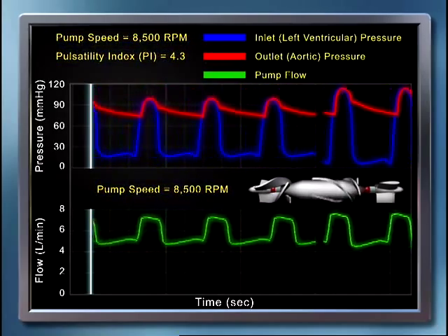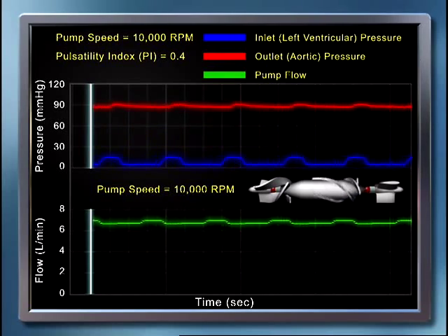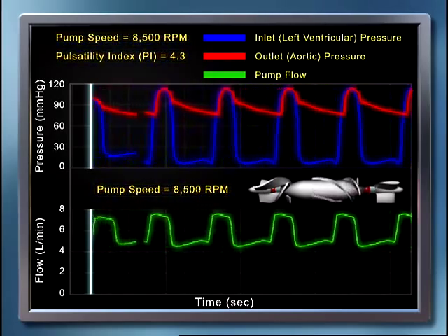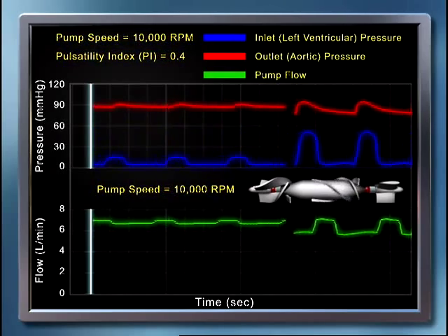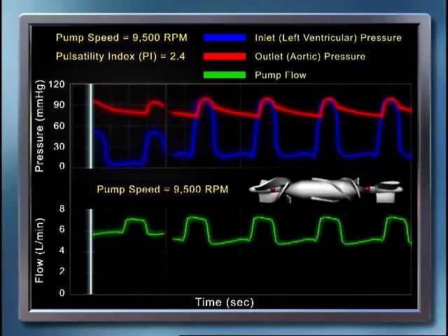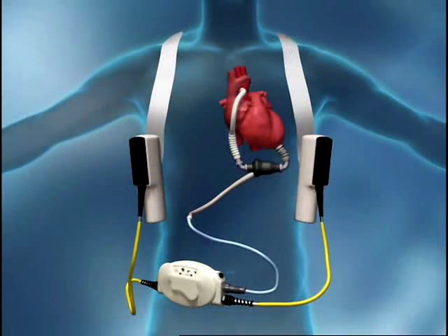If the pump speed is increased high enough — in this case past 8,500 RPM — the ventricle is unloaded to the point where the ventricular pressure will not be high enough to open the aortic valve. In other words, the ventricular systolic pressure will not exceed aortic pressure. When this occurs, the left ventricular output will flow through the pump and the aortic valve will remain completely closed. As pump speed continues to increase and the ventricle is increasingly unloaded, the flow and pressure waveforms become flat as the pump takes over the cardiac output, and the PI value becomes very small.